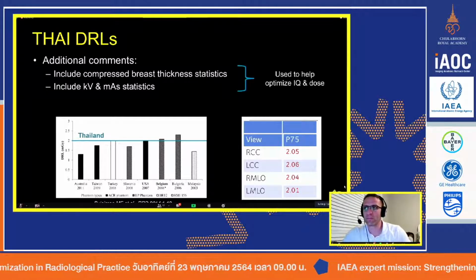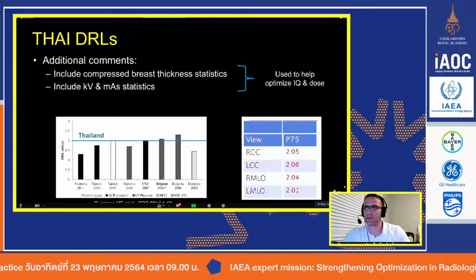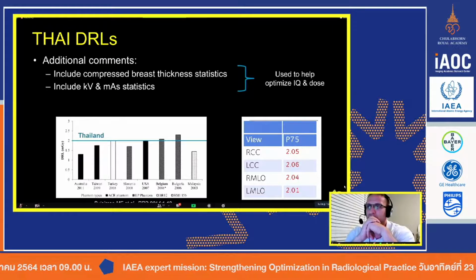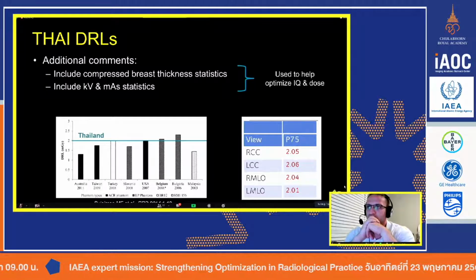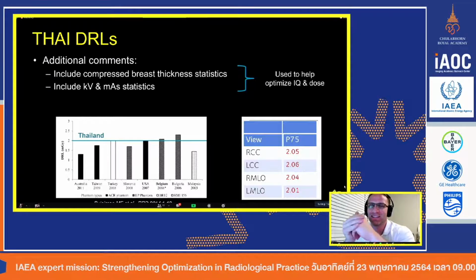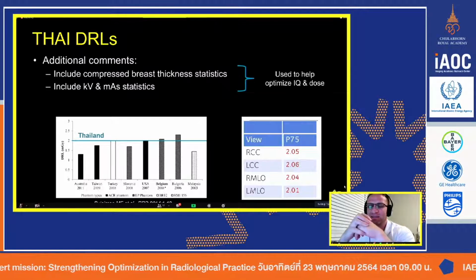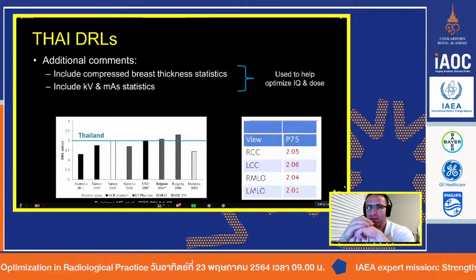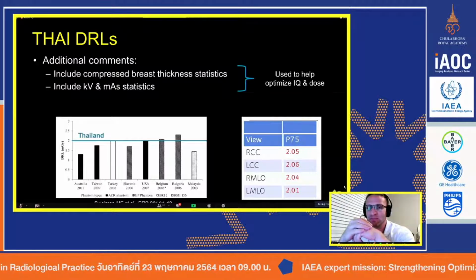And the second question that I have for you, you mentioned a lot about the tungsten filter. So you mentioned a lot about a tungsten and rhodium filter. So this is the filter for the future, right? That's going to give better image quality and also reduce radiation dose. And most of the vendors are going to move towards that filter.